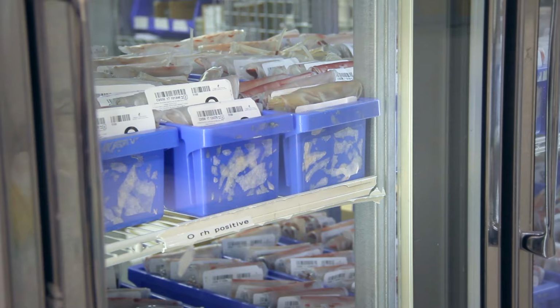So the second thing we do is actually manage the blood products that we get from the Canadian Blood Service. We bring them in, we store them, and then when the patient needs them, we will get them out. So the third thing is actually matching the product to the patient by cross-matching, either in tubes or in the computer. There's many different ways of doing that. Well, that's pretty important stuff.